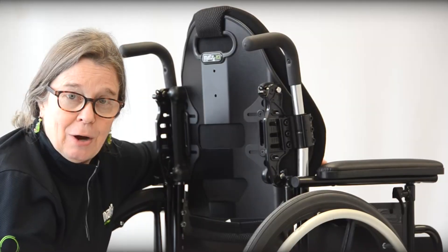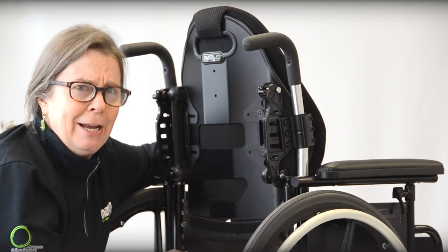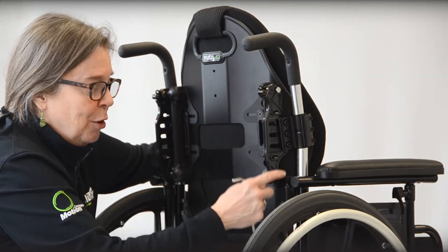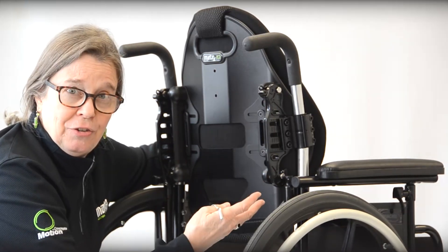We've talked about the value of this hardware for support and stability. A lot of times these taller backs may be used on a manual or power chair that has tilt, or tilt and recline. So we want the value of this broader pin span for all that stability. We just want to show you a quick review of the adjustable range with this hardware.